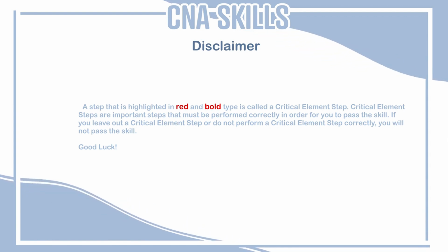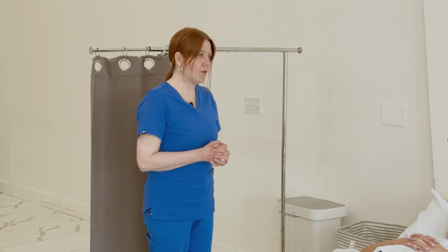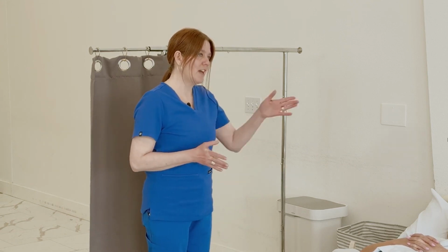Good luck! In this video, we will be looking at skill 14, assist a client to ambulate to the scale. The only thing that you should need for this skill is the patient's shoes and your scale.